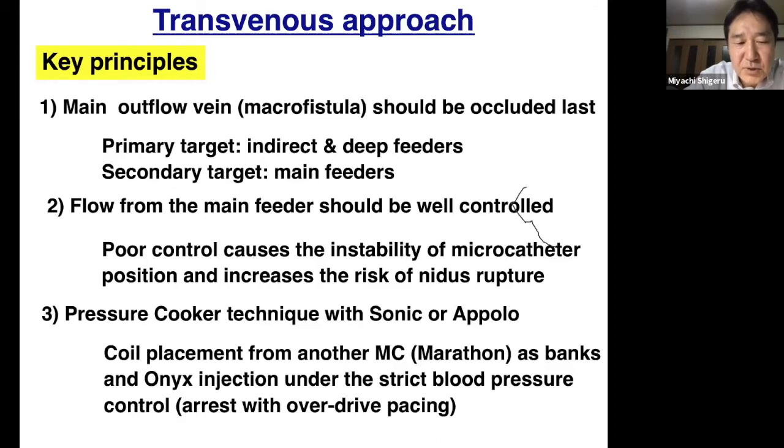But in the near future, a big breakthrough will be coming, and we can have a chance to embolize the AVM from transarterial and transvenous routes, with a good effect, and so maybe a successful occlusion. Of course, nowadays, our goal of AVM treatment will be total occlusion.